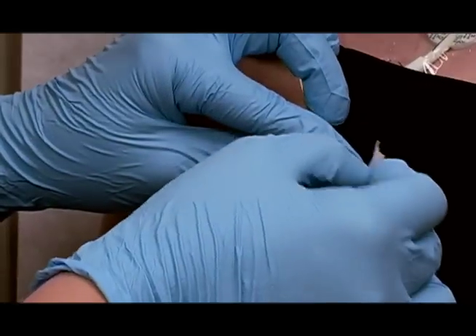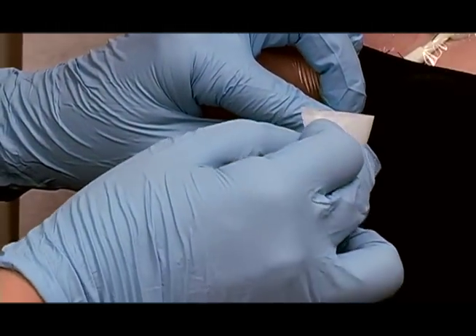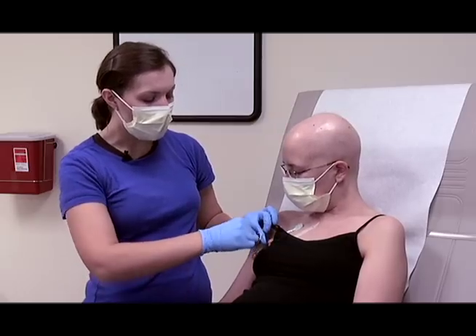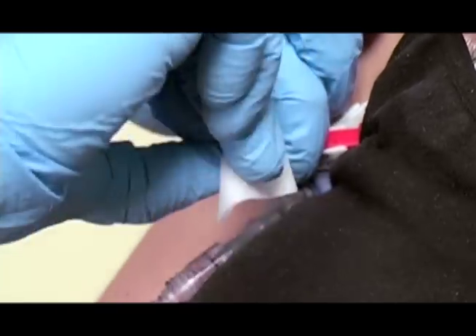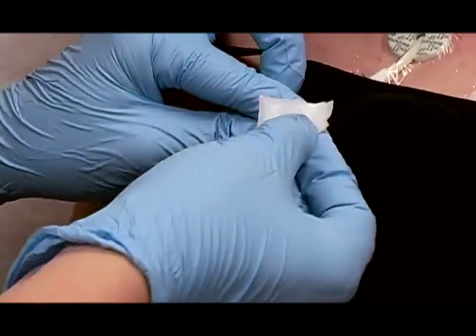Next, take an alcohol wipe and scrub the cap. So what I like to do is take the center of the alcohol wipe and fold it over the cap, and then I do a back and forth turning motion. The outside edges and flat surface of the cap should be cleaned.